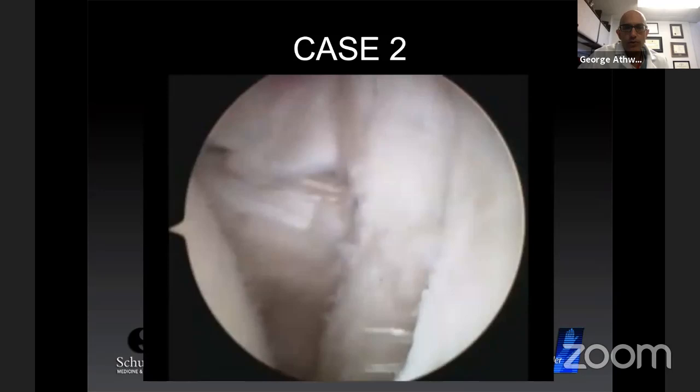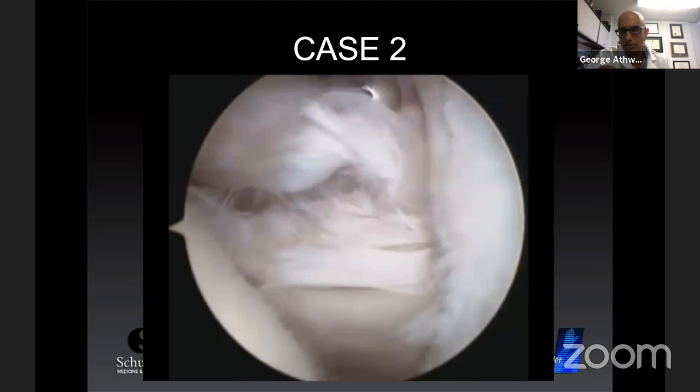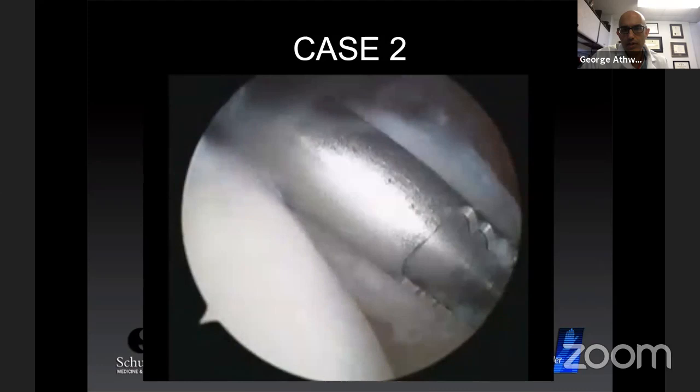We're viewing from posterior. And the first thing you'll notice is that with the subscap tear, if you remember, the MRI showed it was a complete disruption. But when you look at it, you see all of this tissue in the way. And this tissue is non-structural tissue. So you have to debride it. And so there's a subscapularis right there, hidden back there. So I'm going to come in with the shaver and I'm going to remove this lateral tissue to allow me to identify the subscapularis. So as I remove this tissue, the subscapularis is going to come into view. So there it is, right there.